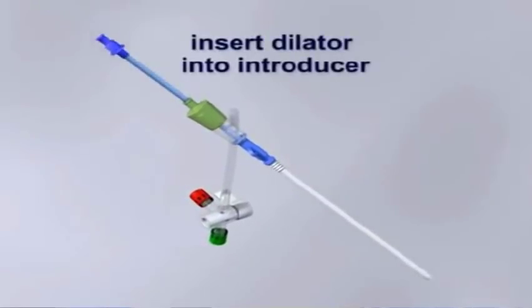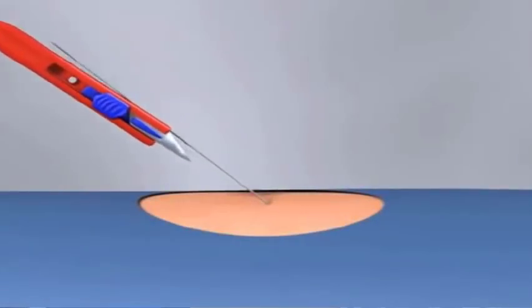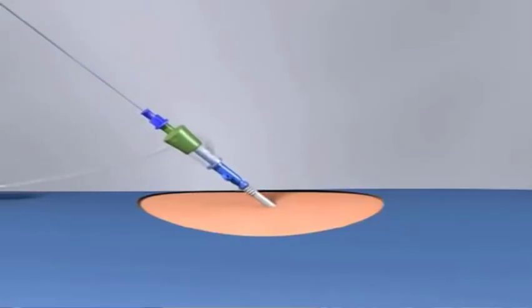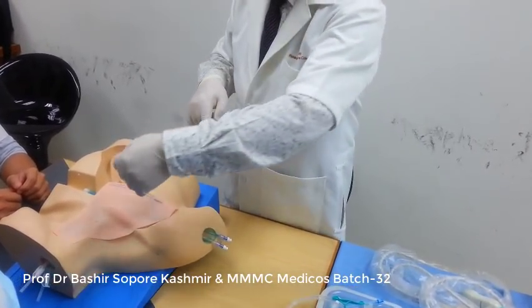The sheath introducer is like this, and it has a side port through which you can do infusion, or you can draw fluid, you can draw blood and all that. So it will be like this when we introduce it. In the sheath catheter we put the dilator. You understand my point? So along with the dilator and along with the sheath we pass it over the guide wire.